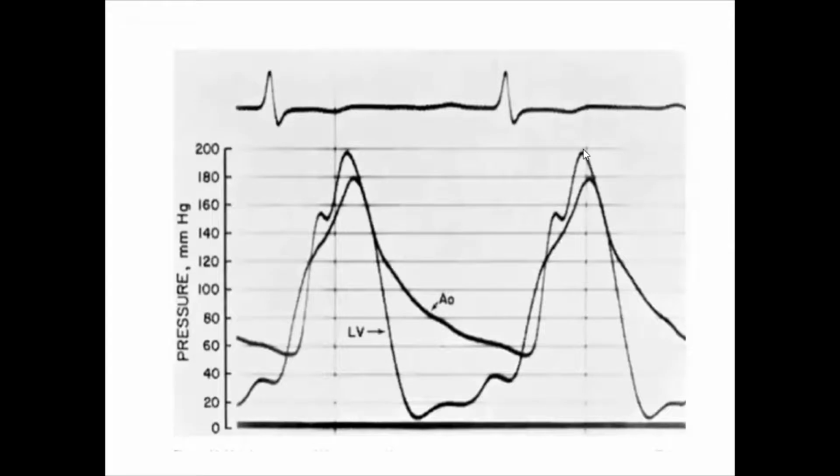So you said there is a wide pulse pressure going with severe aortic regurgitation. The other thing, high LV EDP. And what do you think about this? The presence of an anacrotic notch also. So the diagnosis is severe AI.